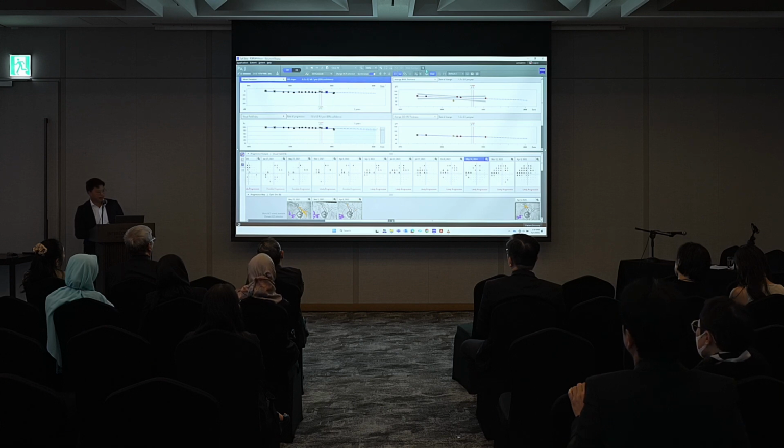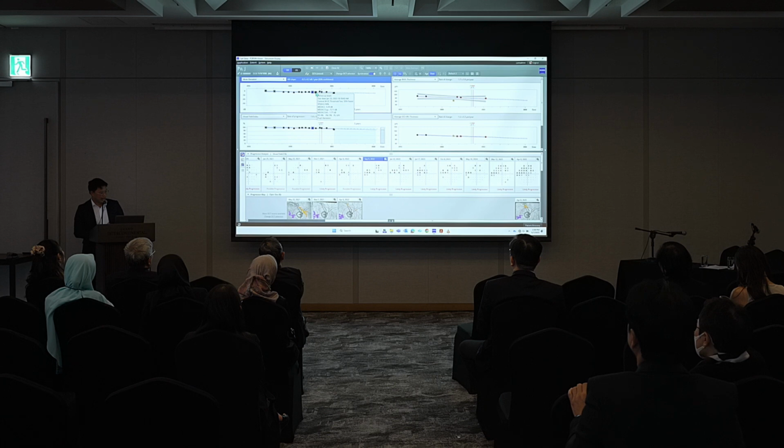I basically do it in clinic, and Manchima touched on this, which is basically setting a dual baseline. So here's a patient that's been seen, and if you mouse over this, you can see that this is a result from 2017. And over time, we can see that each date is tabulated with a summary of their indices. If we add a dual baseline now, so if I click on this button up here, we can actually then add different kinds of events over time to actually set different trajectories.